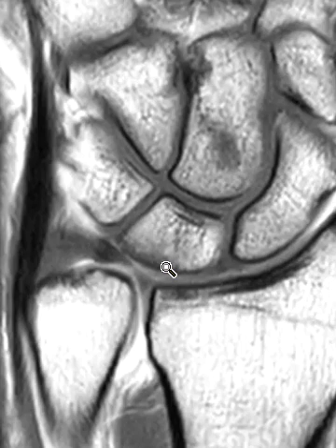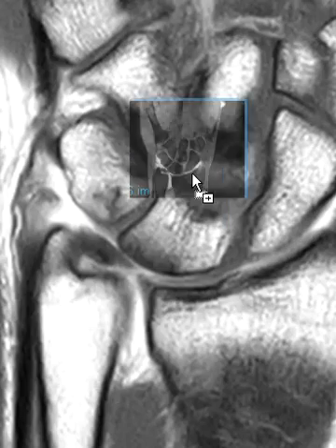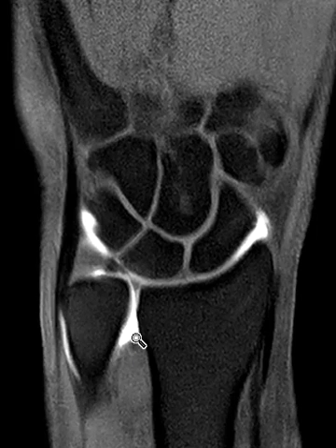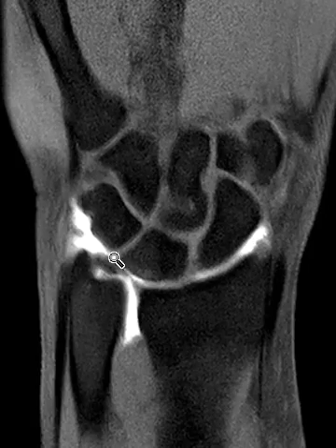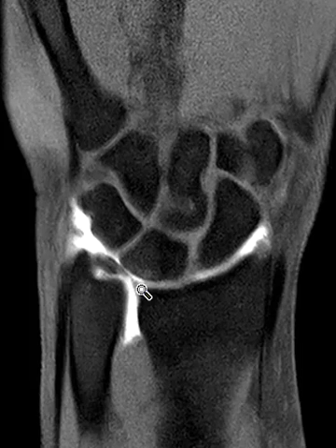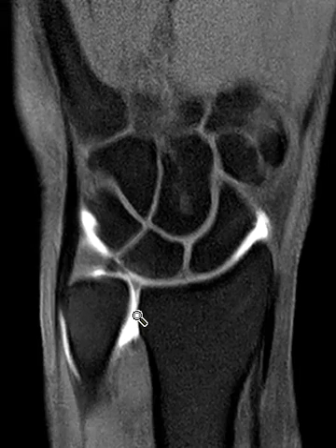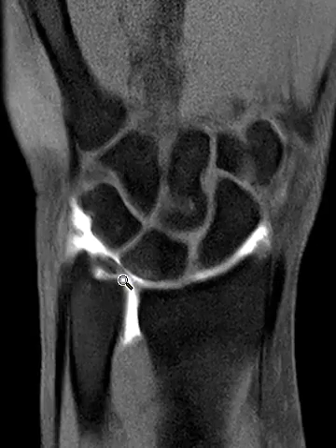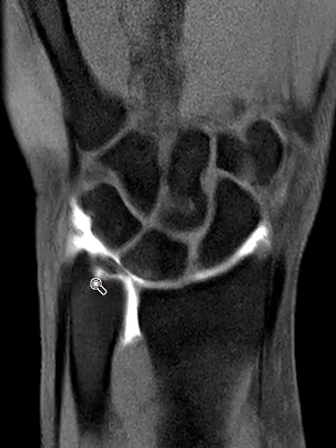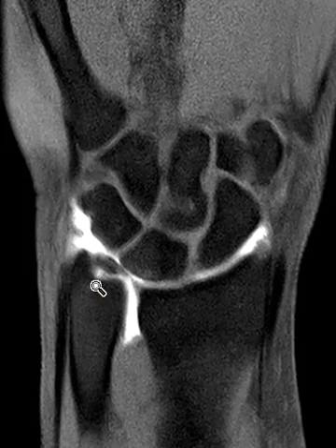There's fluid in the proximal carpal row — we put up the T1 weighted images here. On this view you can see the arthrogram contrast in the proximal carpal row, and you can see the contrast is distending the distal radio-ulnar joint, going through that little tear, and also tracking over here underneath the area where there's a suspected tear of that foveal attachment.